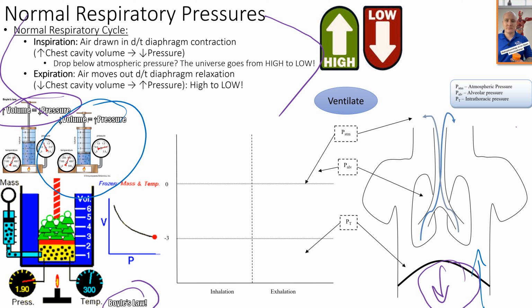The reason I bring this up is because this is what explains how BiPAP modes work. Our waveform is going to look like this on the monitor, and also our ventilators. So we'll see the waveforms. Oh, that's where they took a little breath, right? Because we create a negative pressure initially when we inhale. We create a negative pressure, right? So when I misspoke, that was a mistake. I self-correct because, oh, no, you create a negative pressure first, right?